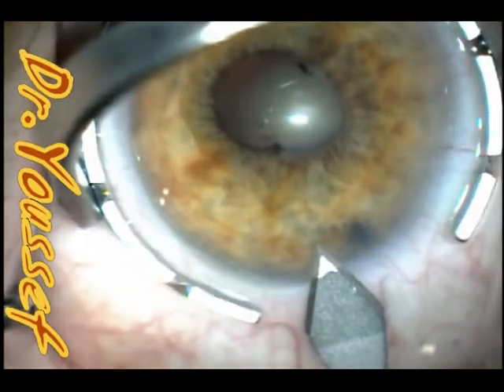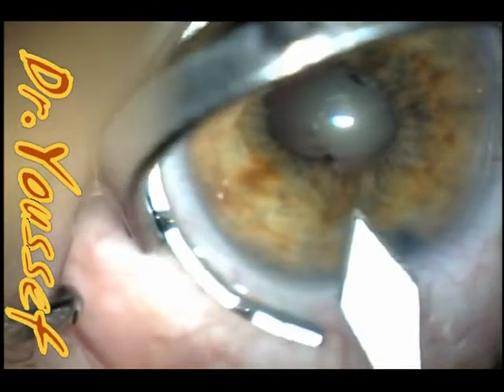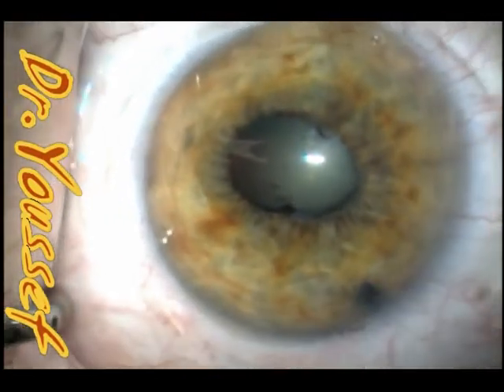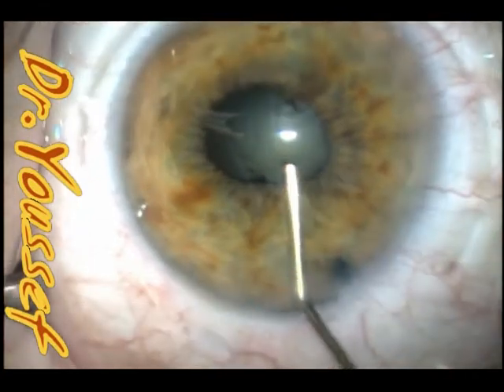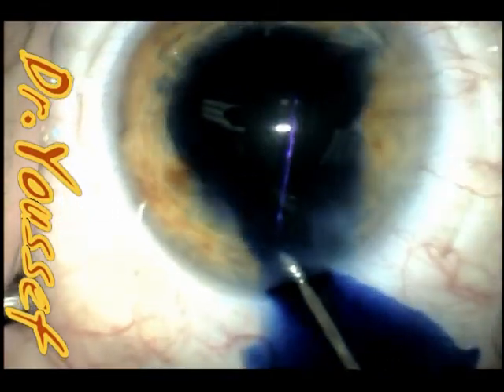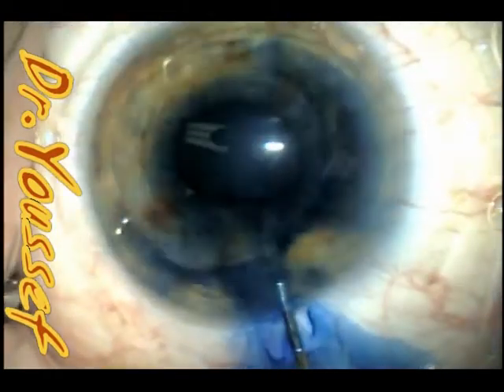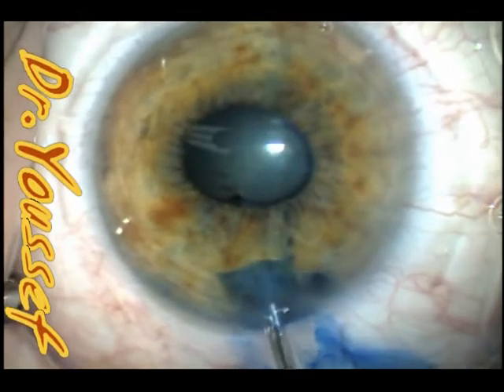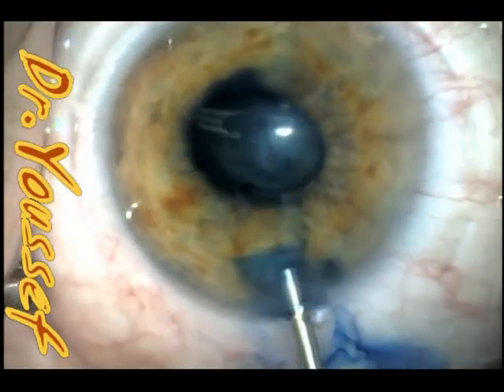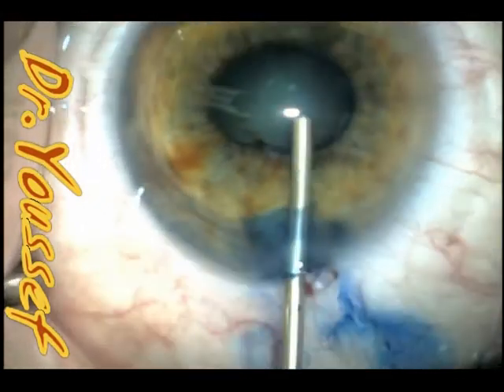This was a case of nanophthalmos. She has a very small pupil and posterior synechiae at most of the clock hours. This posterior synechiae was a side effect of the peripheral iridectomy done years ago. She also had a nuclear cataract that I had to remove, along with a very shallow anterior chamber.